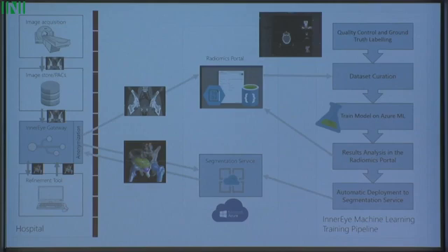We've also built visualization and debugging tools to help with inspecting the results, understanding that results are produced for the right reasons, and so on and so forth. Furthermore, we have training infrastructure in place on Azure, which allows us to scale out over hundreds, thousands, and even more images. And finally, we have infrastructure in place which allows us to deploy models for research purposes at a number of centers.